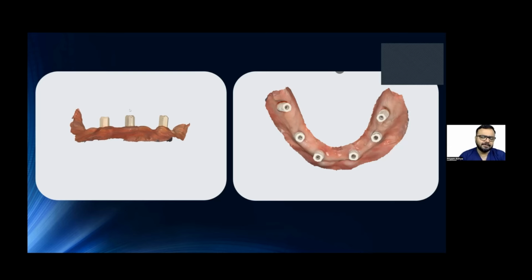Maxilla is a little easier as compared to mandible, but with the right protocol, I think both should be easy for you. Of course, it requires a little bit of practice at our ends. So what is my take-home message for all of you?